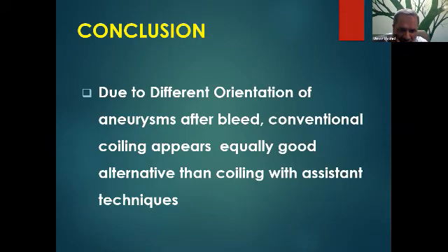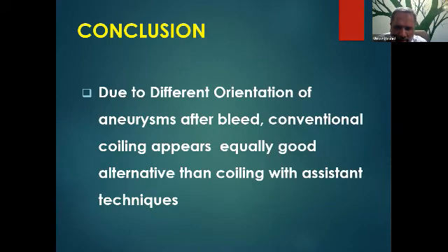Yes, in a few cases we feel we are not able to make the total packing, and we don't want to involve any perforator. Yes, there is that, but this is seen particularly in large aneurysms. So this is our experience, which I just want to share with you. And I feel this can still be done, and with time, because of knowing more about perianeurysmal architecture and the size and shape of the aneurysm.